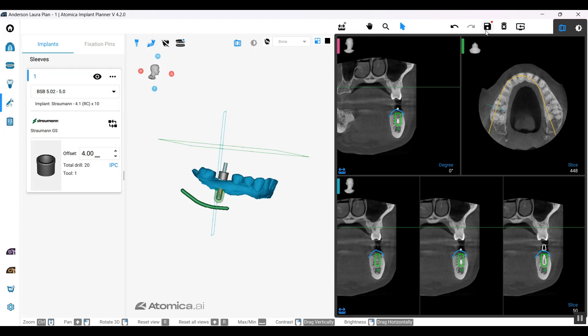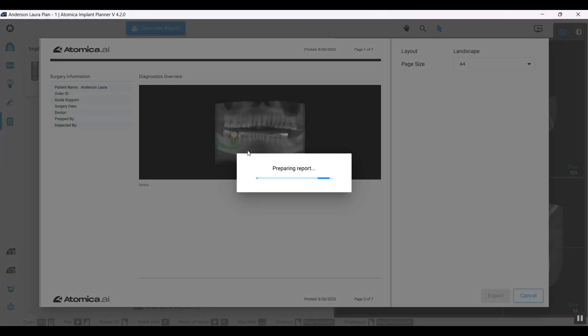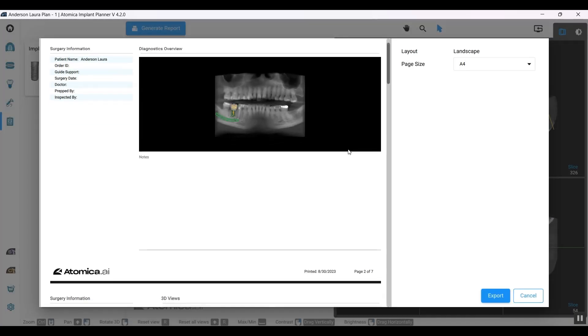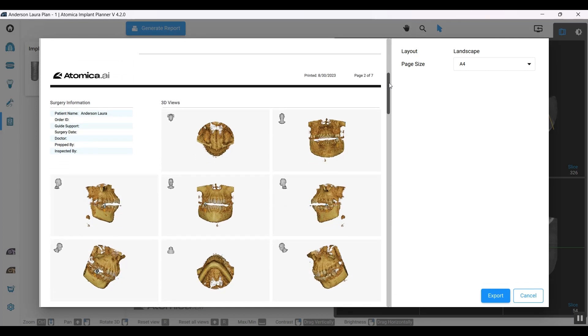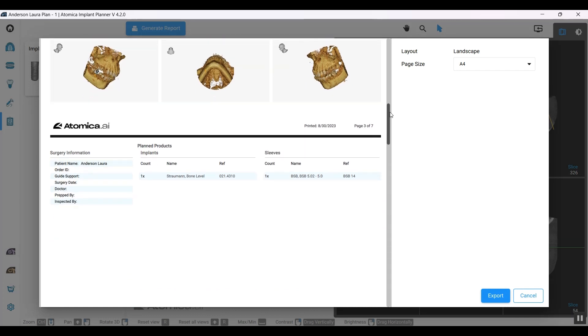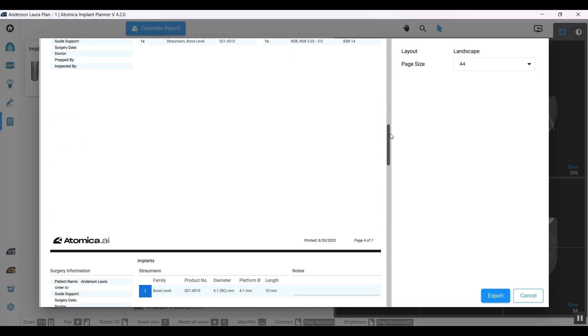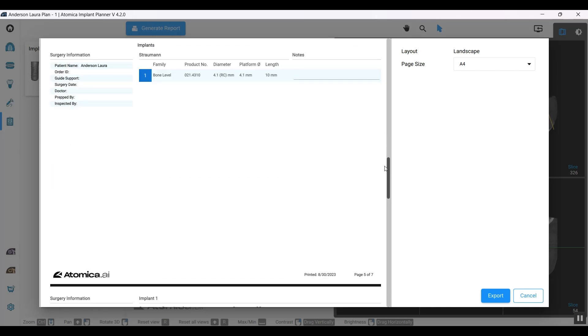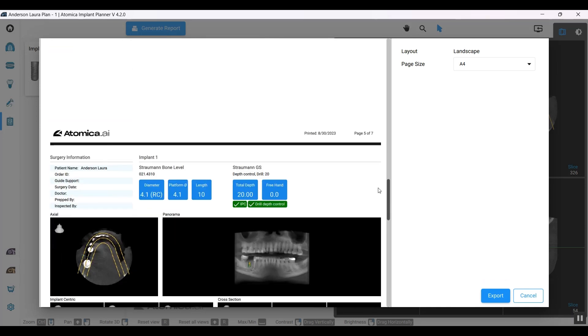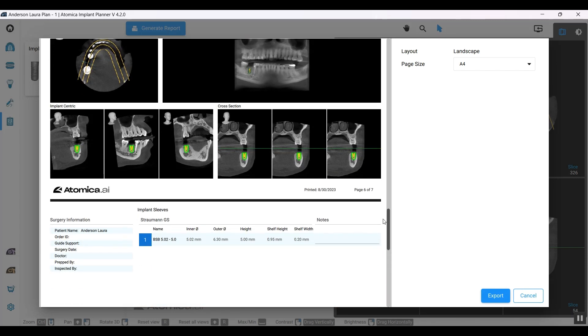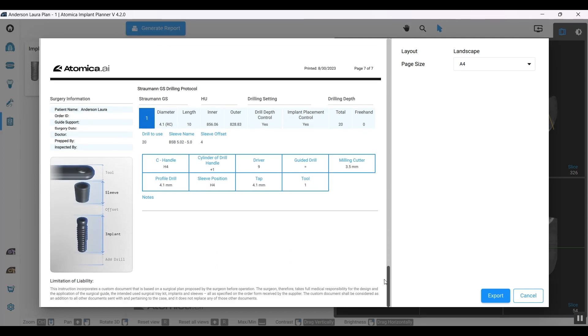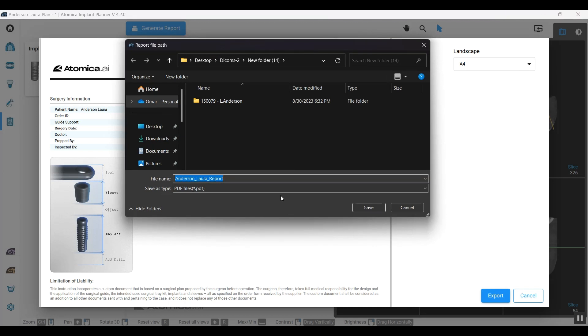Let's save that. Last but not least is our report. Let's generate the report. The report is pretty informative and gives a brief information about the scan from different cross sections and the implant products, which is Straumann, and the sleeve being used, along with the bone density, whether it supports IPC, the drill depth control, and the drilling protocol. This is the drilling protocol you might need to follow to be able to do the right treatment for your case. Once you're done, you can export that into PDF and send it out to your colleague or lab.